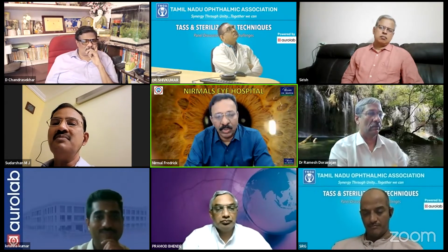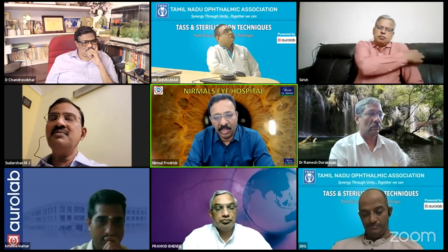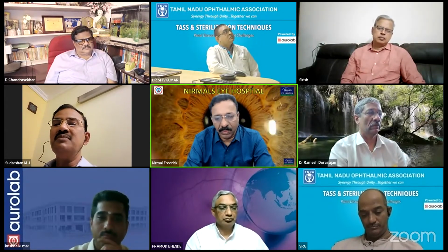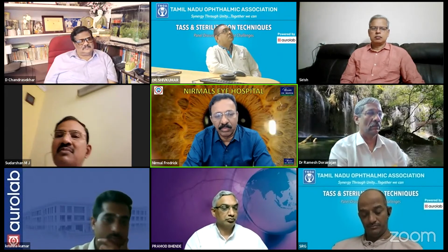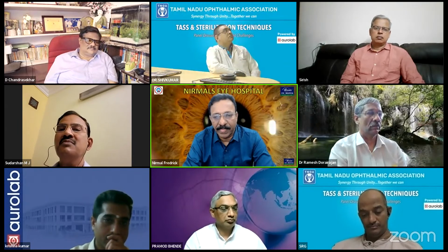So these are going to actually increase the incidence of TASS, because with chemical or heat sterilization, we are altering the pH, we are altering the constituents of the material we use, and we are also altering the surface of the lens if we re-sterilize it. So we have to have this in consideration before devising a reuse policy and re-sterilization policy.